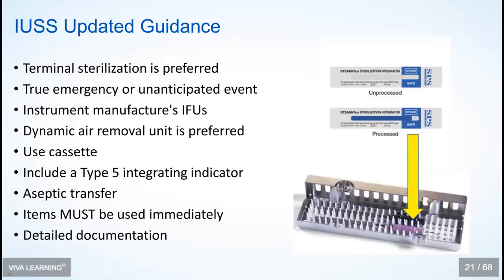You must read the instrument's manufacturer IFU to know what the IUSS protocol is. It actually has to have an IUSS protocol listed on that instrument IFU in order to be able to process it that way.